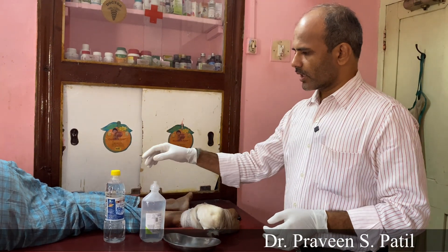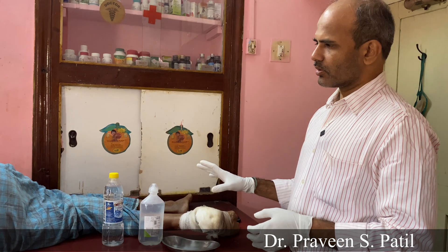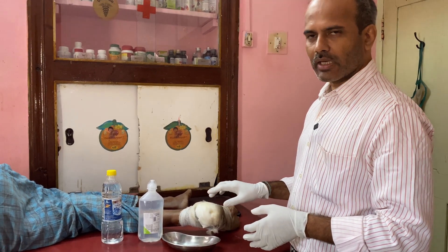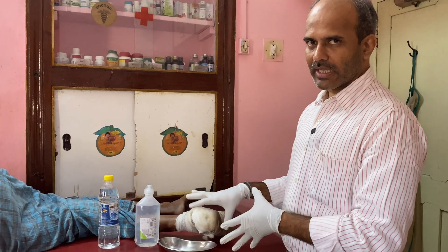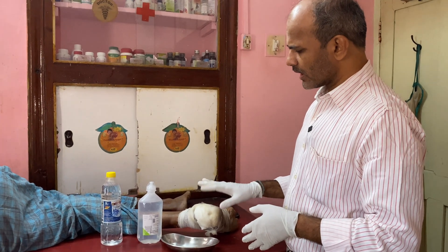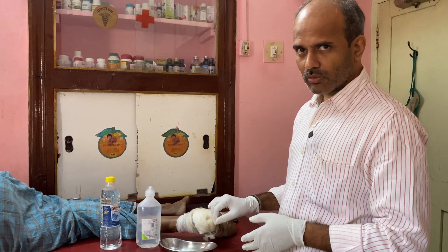Today I'm showing a dressing method for the diabetic wound. This is an 80-year-old male patient who underwent local debridement at the heel. As you know, it's very difficult to get the wound to heal in the heel area because of the less vascularity, and this patient has developed pseudomonas growth.